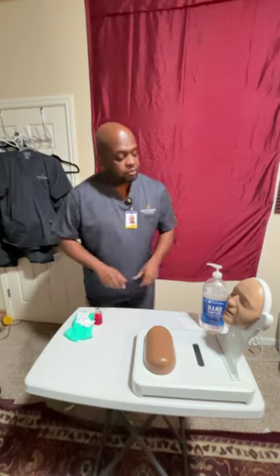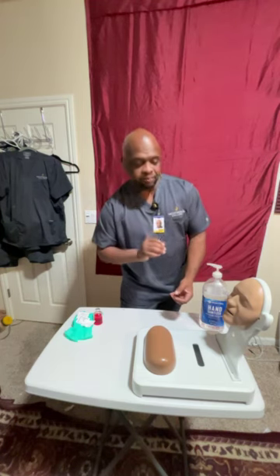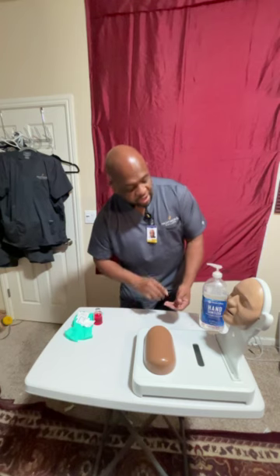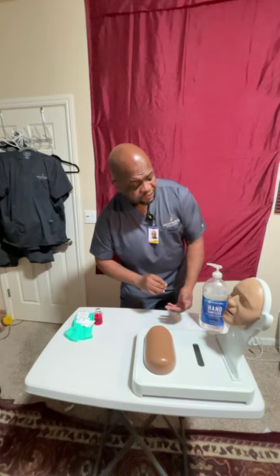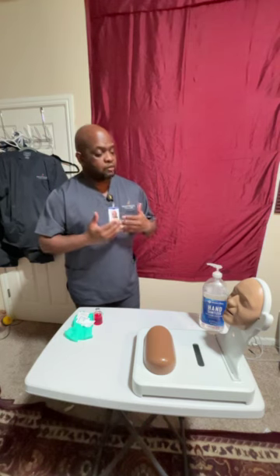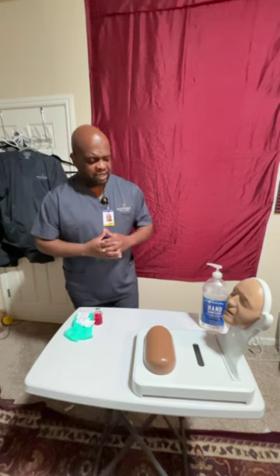Mr. Jones, now that my hands are clean, I'll go ahead and ask for your wristband. I'm going to have Mr. Jones verify his ID by verbalizing what's on the wristband. Mr. Jones, can you tell me your full name and your birthday? Raymond Jones, birthday, March 5th, 1955. Thank you, Mr. Jones. As I stated, I'm here to give you a morphine injection for the doctor's orders. I believe you said something about having pain earlier.